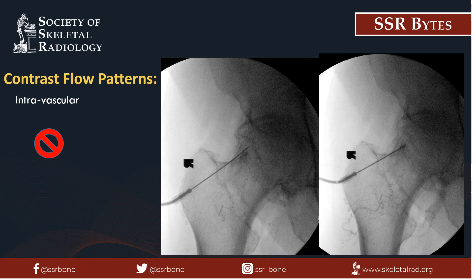This is an example of a rare and important contrast flow pattern, which is intravascular flow. Notice the network of vasculature surrounding the hip opacified with contrast. If subsequent fluoroscopic images are performed without contrast injection, this pattern will likely not persist due to blood flow and washout of the contrast. It is imperative to recognize this pattern and to adjust the needle before the administration of anesthetic and steroid.